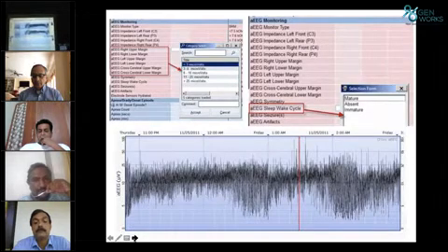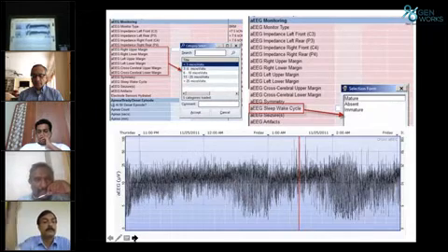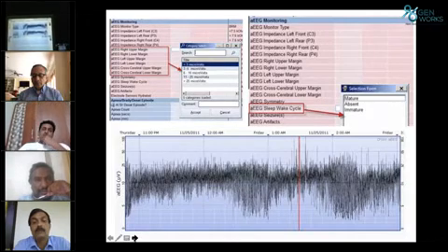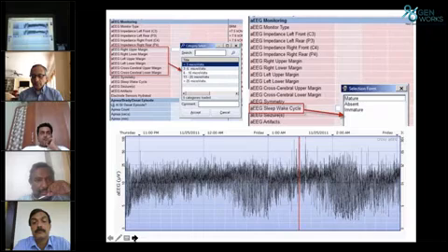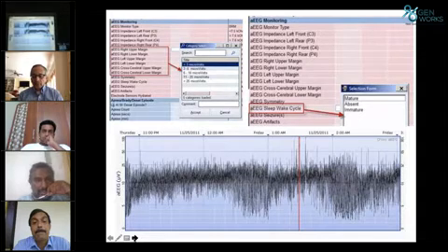Okay, once we are using any electronic device, we have to see the right and left if we are using different channels. Right upper margin, right lower margin, we have to note separately. Left upper margin, left lower margin, whatever the upper voltage, lower voltage, we have to note. And if we are using cross cerebral, then for cross cerebral, upper and lower margin should be noted like this.